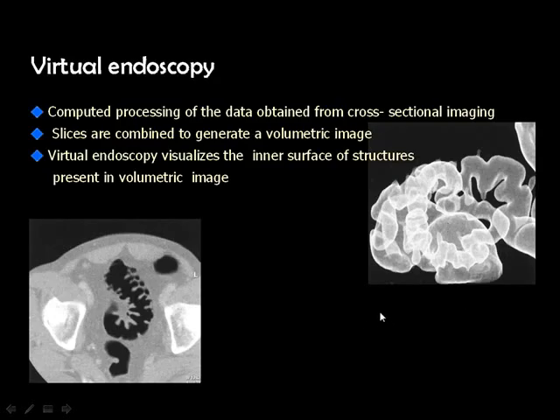Then you know that with the recent machines of CT, you get what is known as virtual endoscopy. That is to say, you can use the camera of the machine to go inside any hollow part in the human body. If you want to go through the colon to perform an examination known as virtual colonoscopy, you first prepare the patient thoroughly. You get rid of every fecal material inside the colon. Then you inject the colon with air.